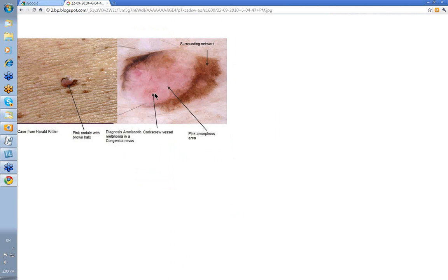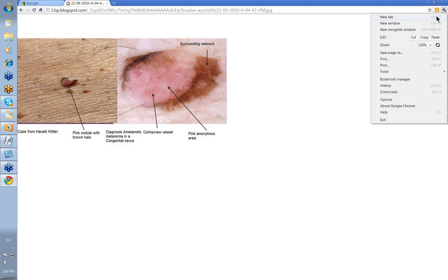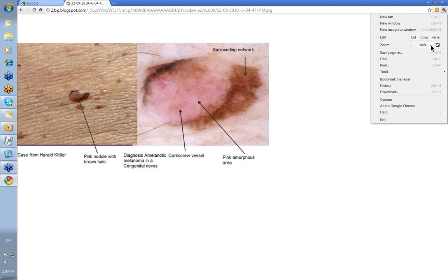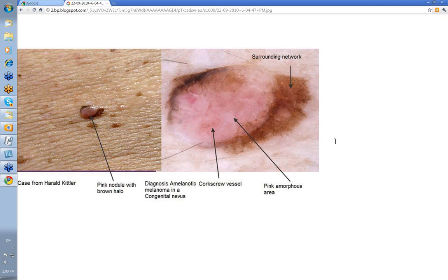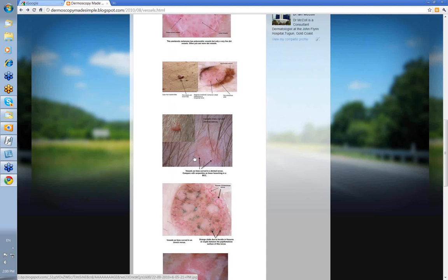This is a corkscrew — a helical vessel. Here you've got a pink nodule with a brown halo. This is a Harold Kittler case, and this was an amelanotic melanoma in a congenital nevus. Here you've got surrounding lines reticular in this pink amorphous area with this helical vessel. So the vessels can help you in some difficult cases.